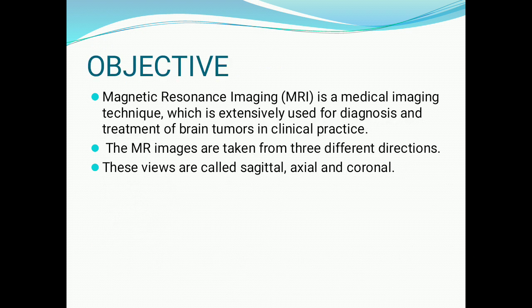Here comes the objective part. Magnetic resonance imaging is a medical imaging technique which is extensively used for diagnosis. Here, the MR images are taken from three different directions. These views are called sagittal, axial, and coronal.